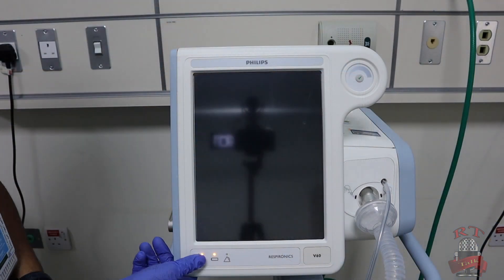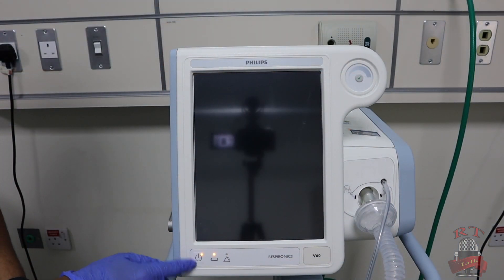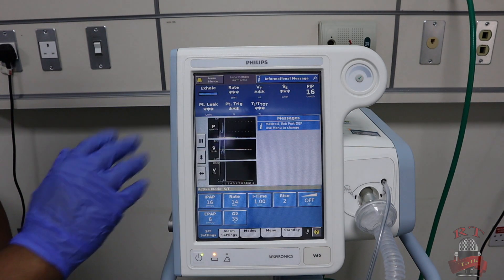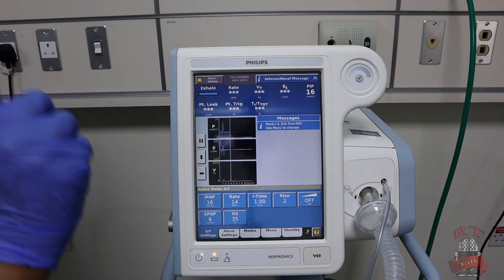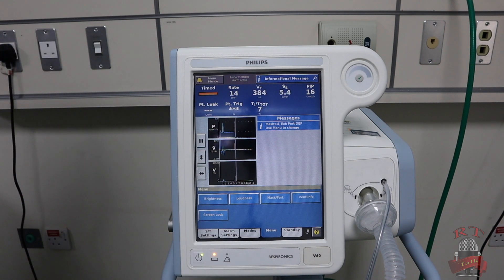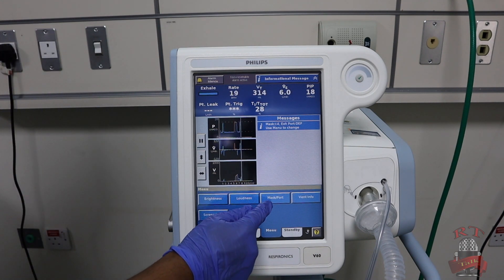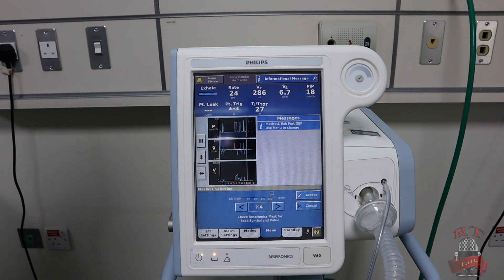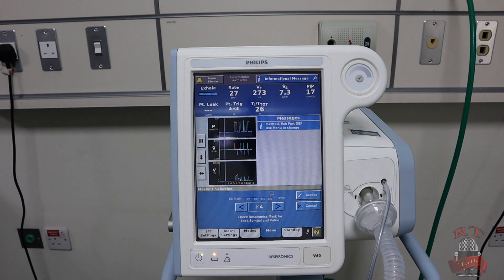We will switch on our machine from the side on the screen. After you start your machine, you will go to the menu, then you will go to mask and port. You will choose the number of the mask you're using. I will show you right now.